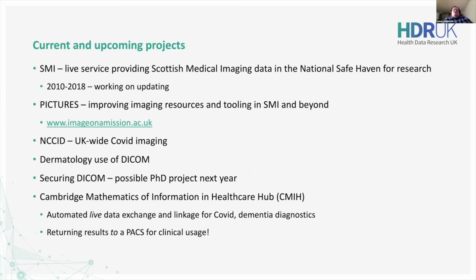So I hinted earlier, there are some security issues with DICOM, including the possibility of embedding malware in it in all sorts of fun ways. You might know from the general internet that it's not particularly safe to open, for example, a Word document if somebody unknown sends it to you. There can be things like macroviruses in there and other malware. So be careful of opening Word documents. Word, to be fair to Microsoft, does now have various safety precautions in there against the worst of these, like macroviruses. It will at least warn you before you open a virus now. But there have still been various exploits and issues with Word over the years.